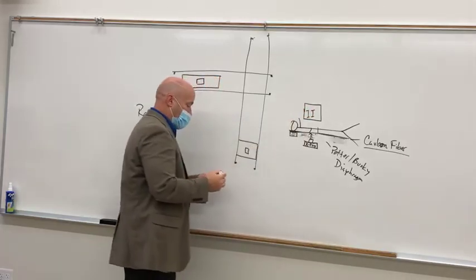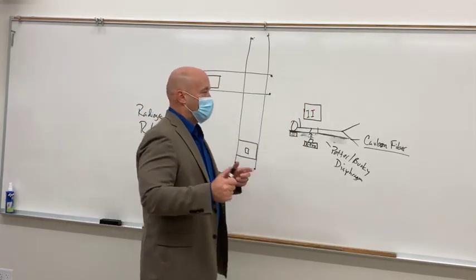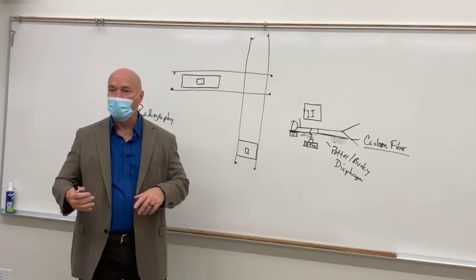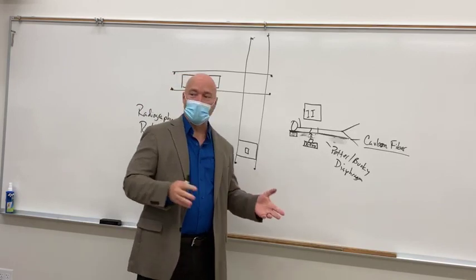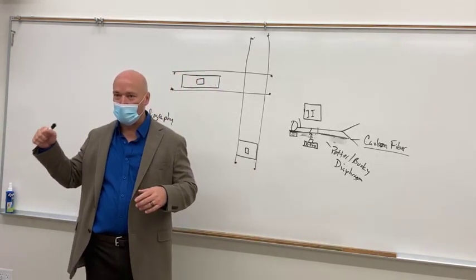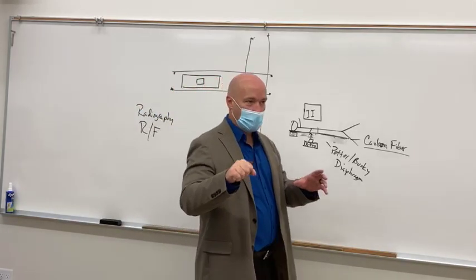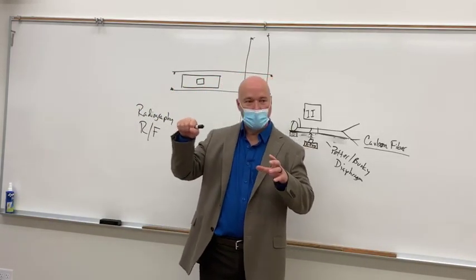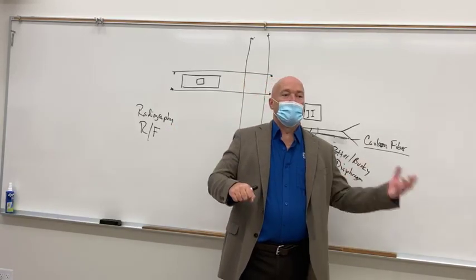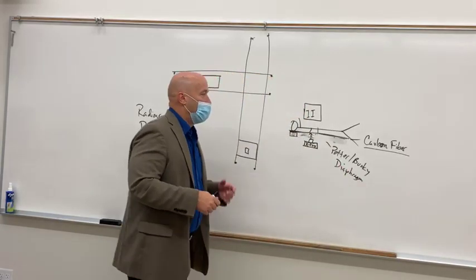This is a big, heavy piece of machinery that's motor driven. So if it's heavy, we've already talked about momentum, right? It's hard to get started and it's hard to get stopped, right? So if you've played with the fluoro unit at all, you know, the handle is what activates the motor. So you give it a little bit of a push in one direction and it takes off, right? So you've got to kind of pull it back in the opposite direction and get it to stop.